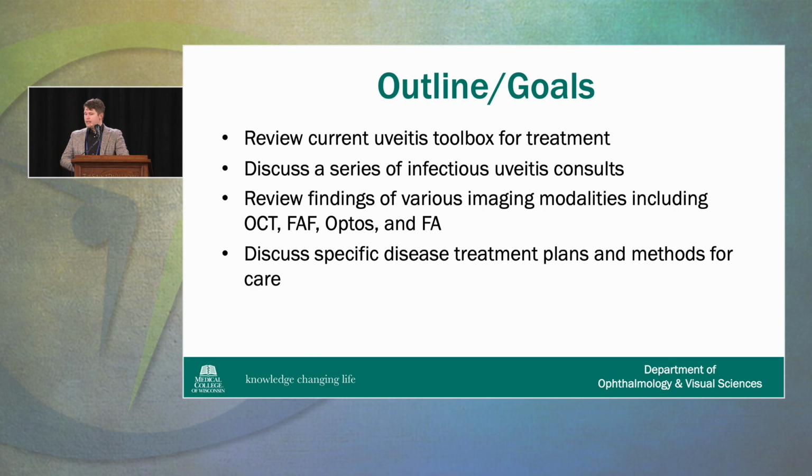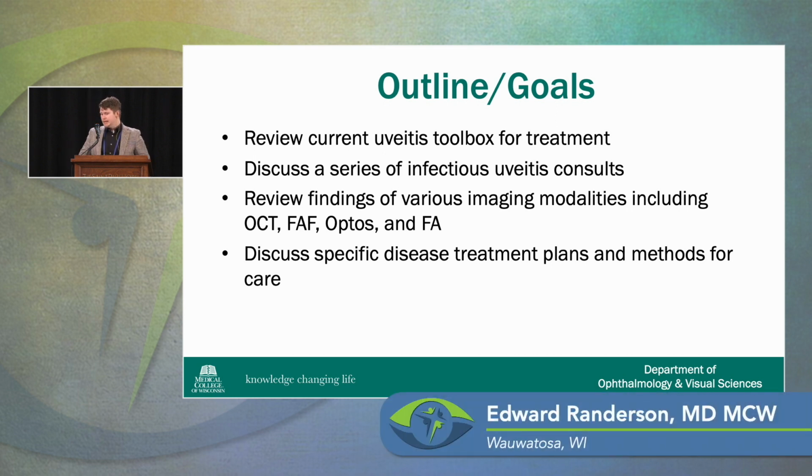So goals today: we're going to review the current uveitis toolbox and treatment pathways. We're going to discuss a series of infectious cases, review findings on OCT, fundus autofluorescence, Optos, and fluorescein angiography, and then discuss some specific disease treatment plans and methods for care.